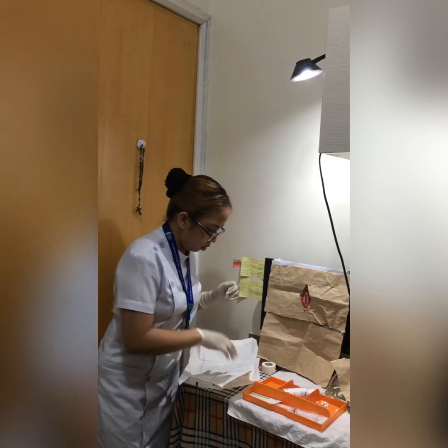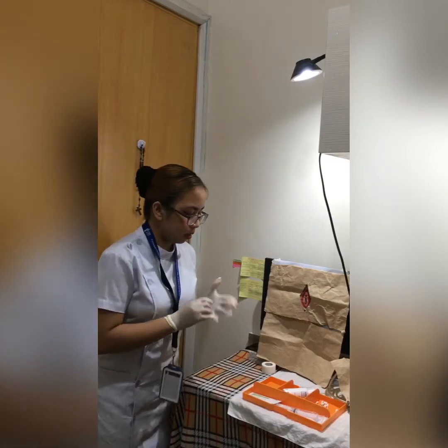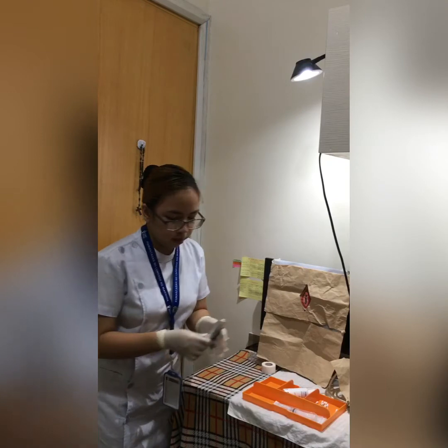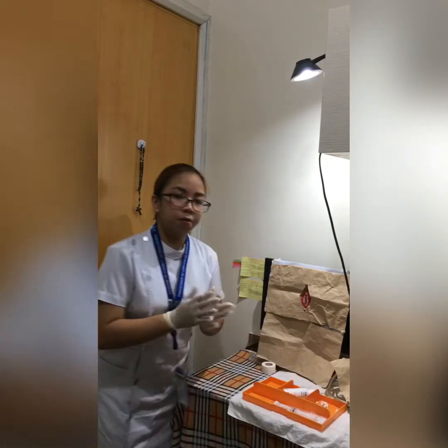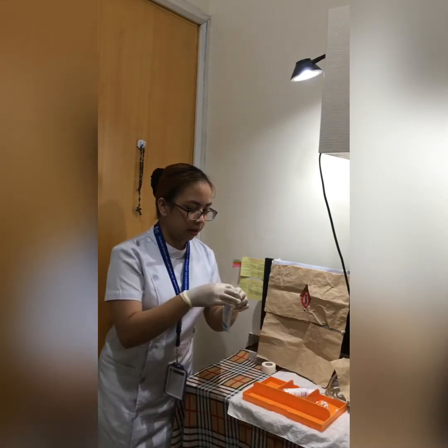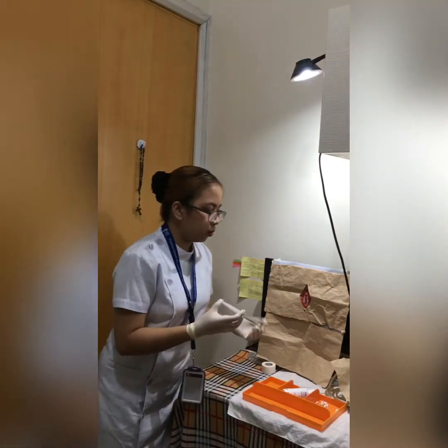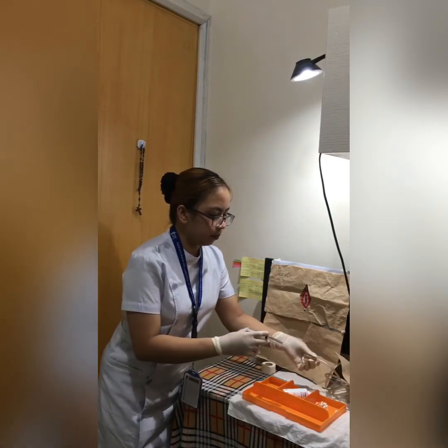So I'm going to dispose of this. Next, I'm going to prepare the lubricant. I'm going to put this in the sterile field, then dispose of it. Then first we also have to prepare the syringe with sterile water.